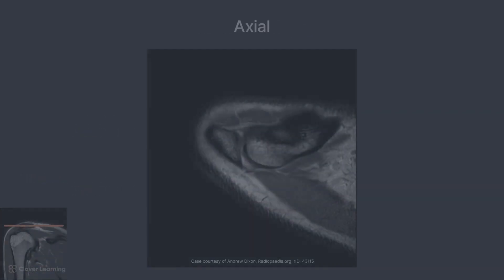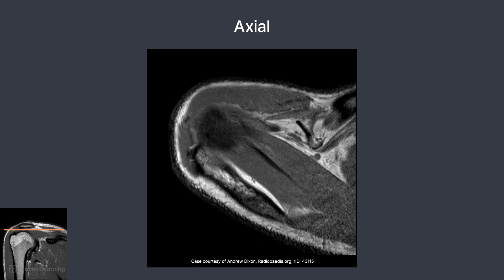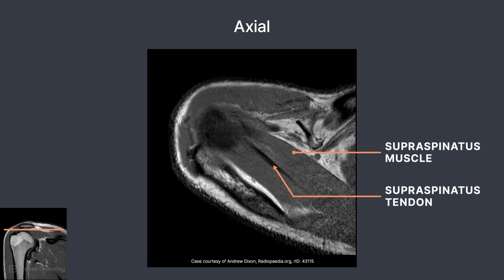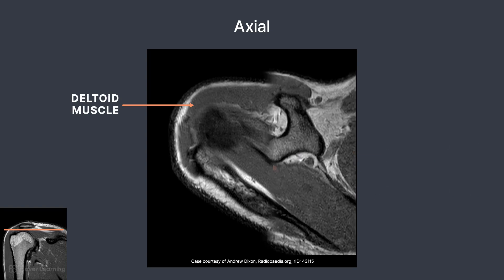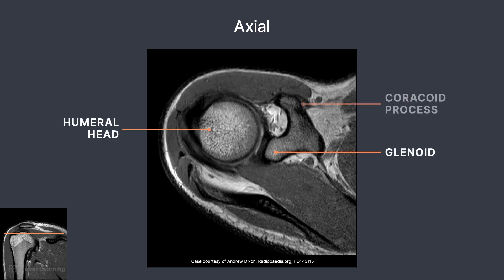Starting from a superior position, the acromioclavicular joint is visible. This is made up of the lateral aspect of the clavicle connecting to the acromion. Moving inferiorly, the supraspinatus muscle and tendon are demonstrated well. The large deltoid muscle is demonstrated wrapping around the upper humerus. Important bony structures on this image include the round humeral head, the glenoid, and the coracoid process projecting anteriorly.